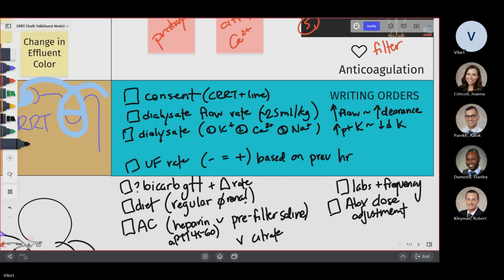The other thing with the CRRT is, now remember one thing, CRRT is a slow continuous renal replacement therapy. It's going to be slow. So your clearances are going to be slow. Your hemodynamic stability is going to be better because you're not going to be dropping your pressures a lot. So you're not going to get good clearances. Mostly CRRT is good for fluid removal.